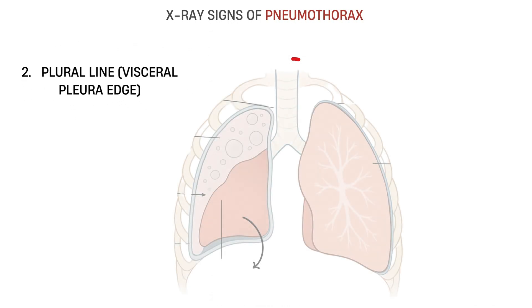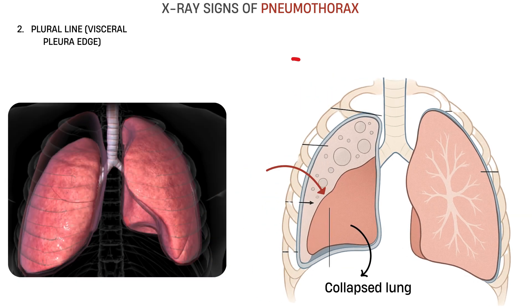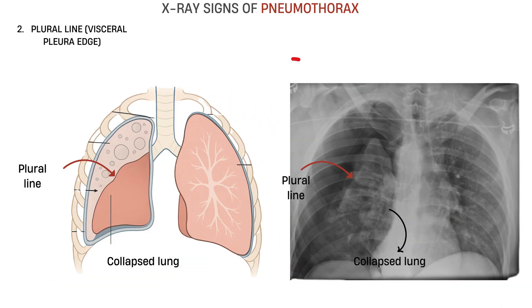Next, the pleural line. As the lung collapses, the edge of the lung becomes visible. This appears as a fine, sharp, white line — that's the visceral pleura. Beyond this line, you see nothing: just blackness. No vessels, no bronchi, just air. This is your classic lung edge, and it's a definitive sign. If you see a white line not connected to ribs or heart, and beyond it is black, it's not normal lung — it's free pleural air.